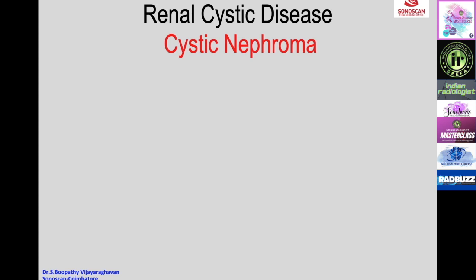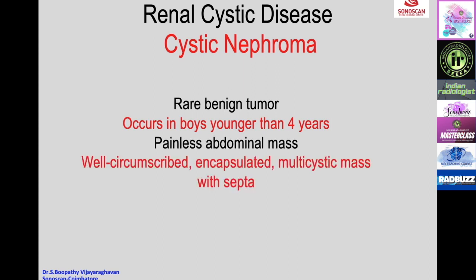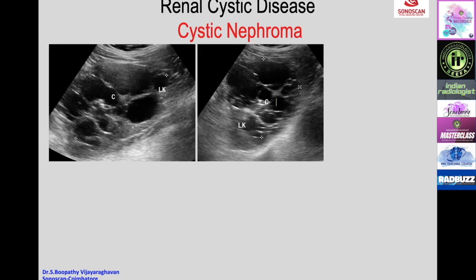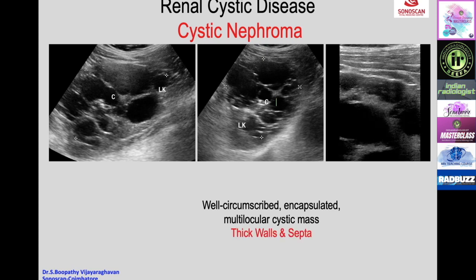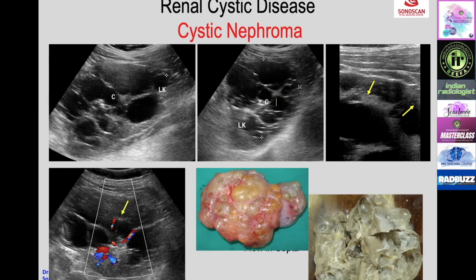Cystic nephroma is a rare benign tumor occurring in boys younger than four years, presenting as a painless abdominal mass. On ultrasound it appears as a well-circumscribed encapsulated multilocular cystic mass with septa. On high frequency, thick walls and septa are seen, and on color Doppler there is flow in the septa, leading to the diagnosis of cystic nephroma.